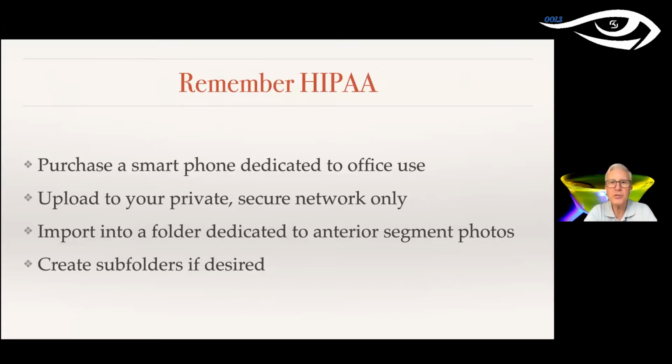When you take the pictures, you want to upload them to a server or another computer where you can analyze them and edit them if necessary. And I would create a separate folder for just those pictures. And then I create subfolders with the patient name. I also have subfolders of certain situations.